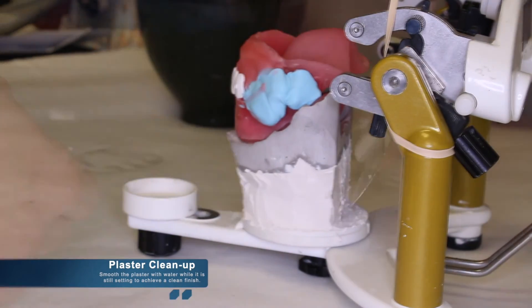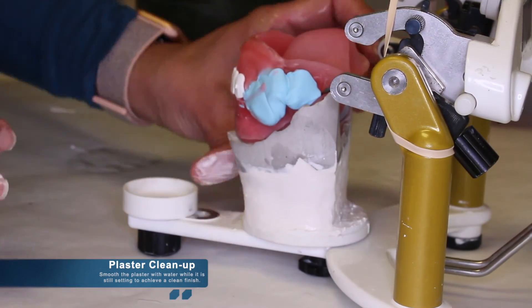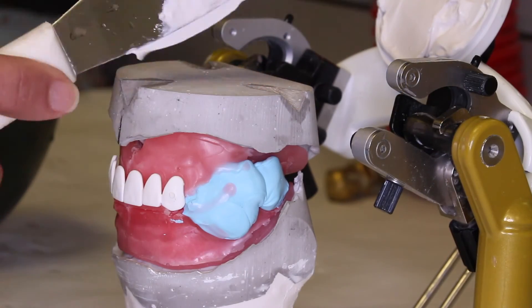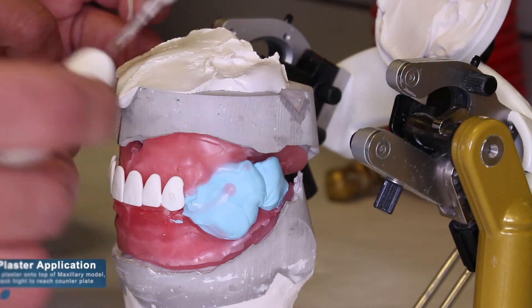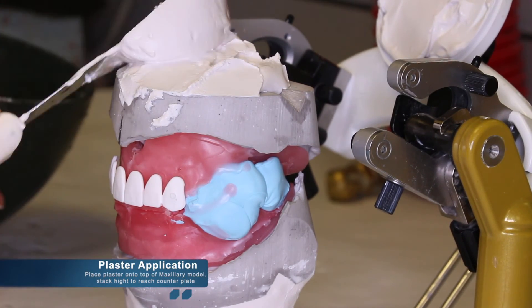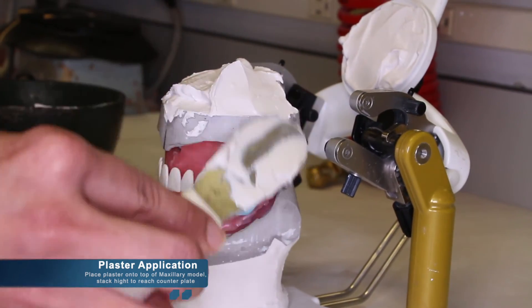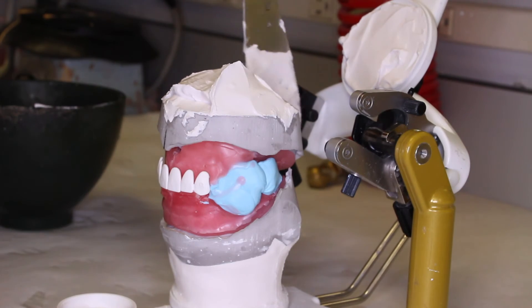For a clean finish without the use of sandpaper, you can smooth the plaster with water while it's still setting to achieve a clean finish. Once the lower model is mounted correctly and cleaned, the maxillary cast can be attached to the maxillary occlusion rim and the plaster can be applied to the base of the model, making sure that the plaster engages the notches or scoring that was done prior.